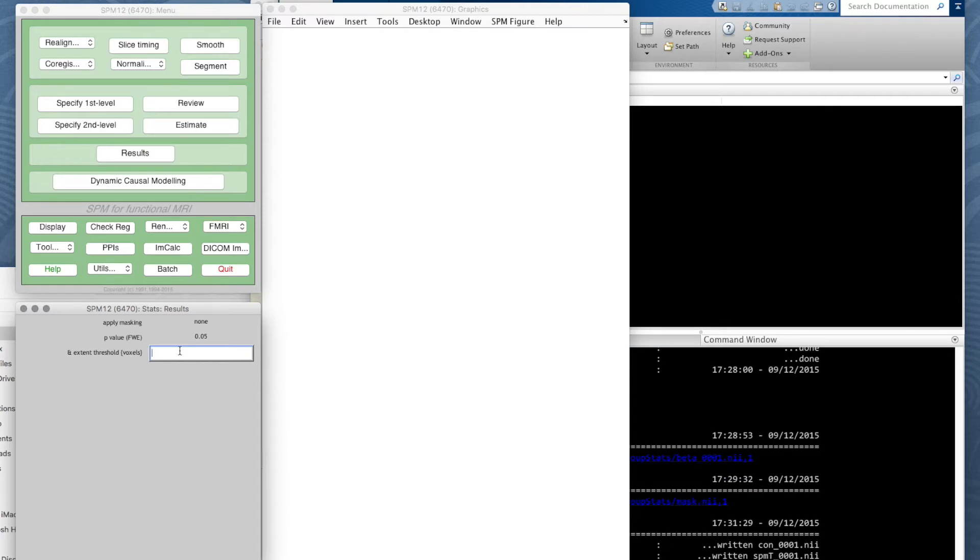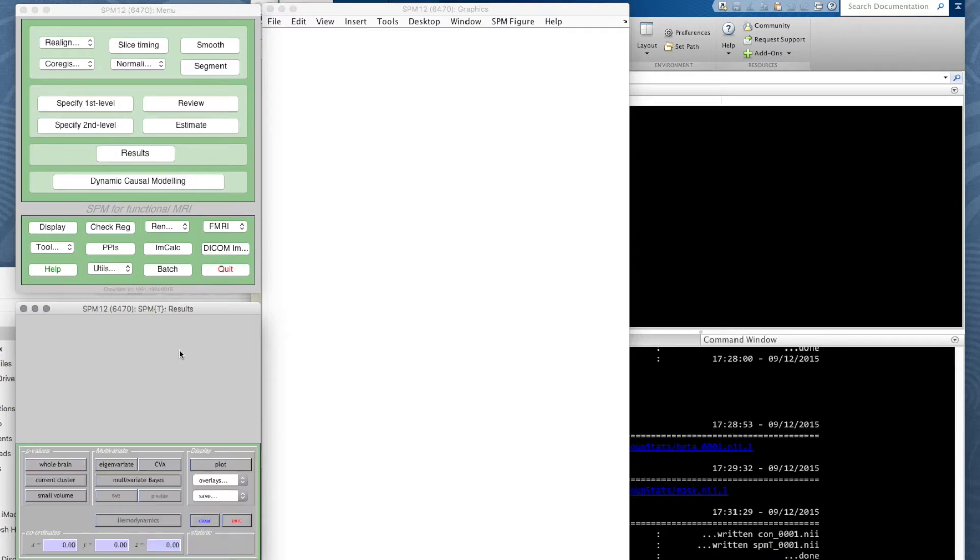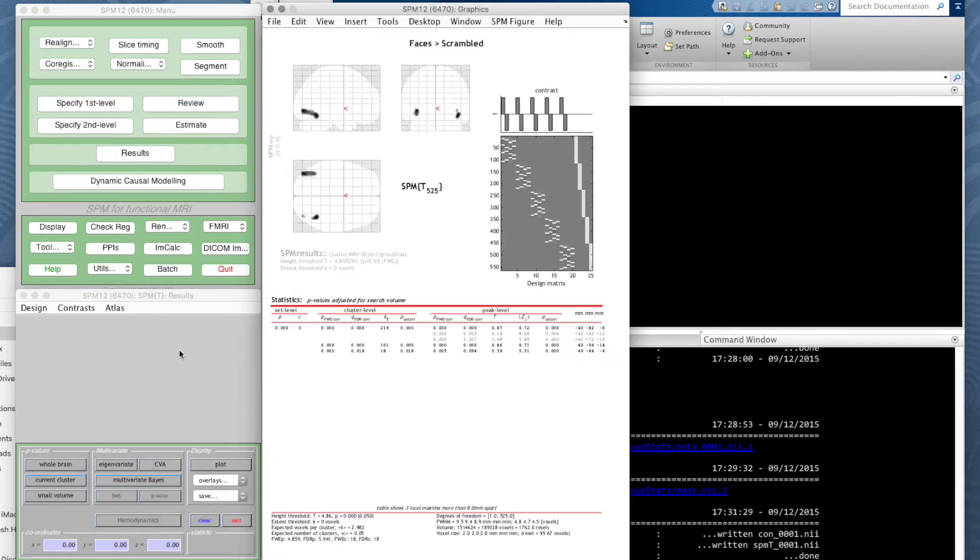We're not going to do that—we'll try showing everything, we've got nothing to hide we hope. Once we've done that, what we get is what's called a glass brain view of this statistic.